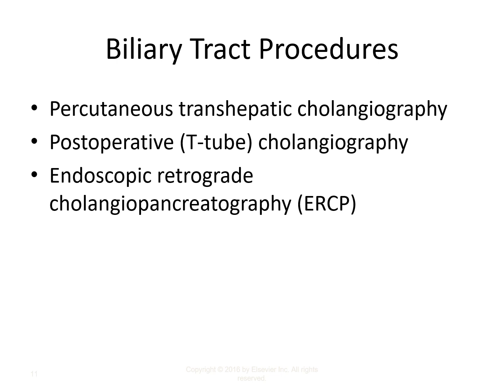So usually the general surgeon, if it's a T-tube, if it's been a gallbladder, a cholecystectomy, back in the day, the best thing they could do was to prevent stones and prevent the aggravation of stones post procedure and allow the person to heal, was they put in a T-shaped drainage tube directly to the biliary system that could drain off excessive bile and relieve pressure while the patient attempted to pass their stones post operatively.